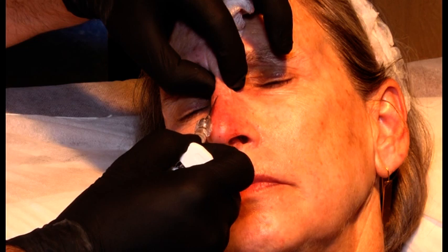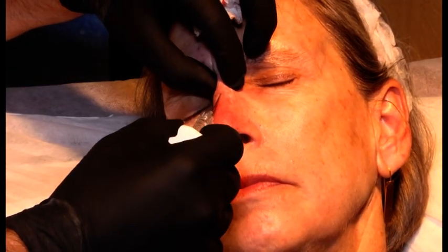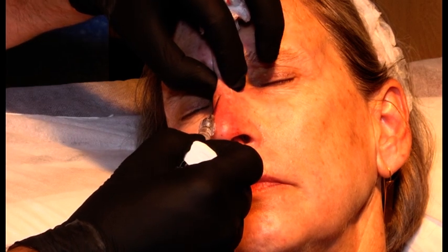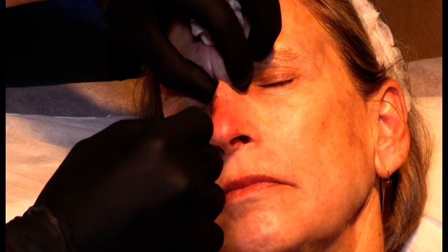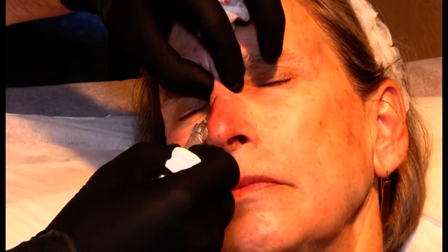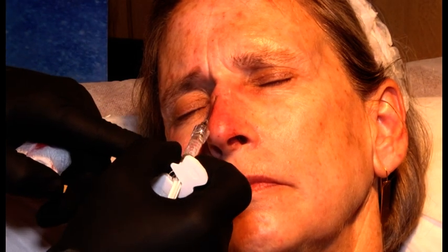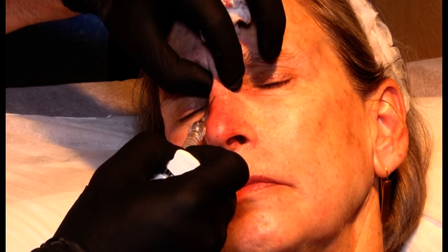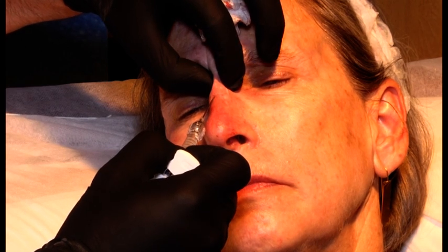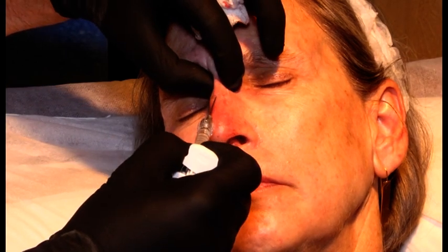Even though she might feel a little bit of discomfort, I take my time because I know it's better to have a little bit of discomfort now than to risk the most serious complication in aesthetic medicine. So every time I press the plunger, I'm looking at the markings, and every time I do not exceed 0.025. I can also do less, that's fine, as long as you don't do more.